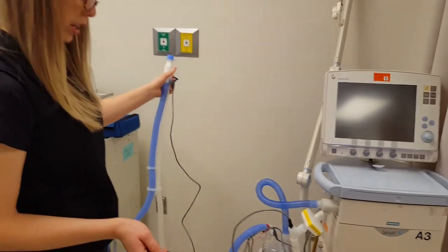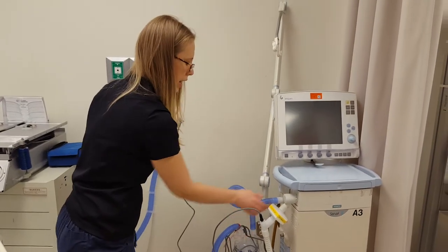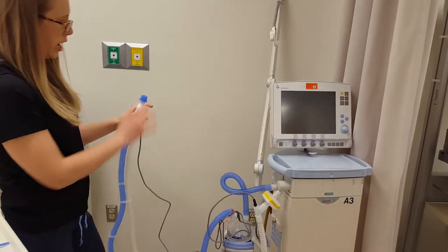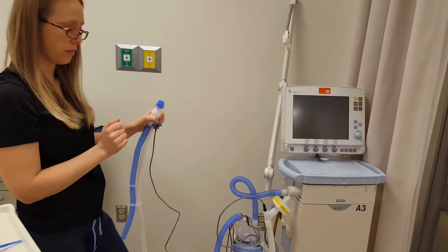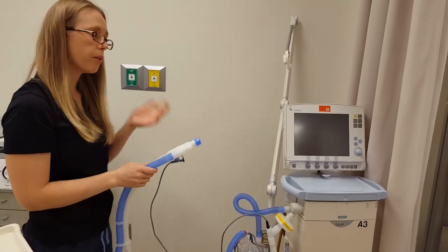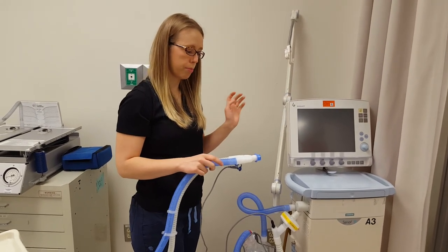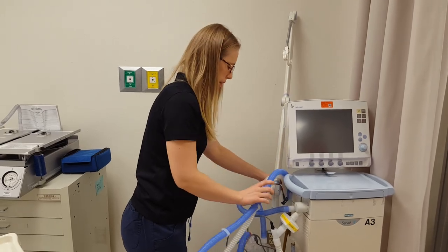Your ventilator circuit is now completely set up. Everything is in nice and tight, connections are secure, and you have a filter and a cap to cover the top of the airway. From here you can perform the check on the ventilator to make sure it's functioning properly before it's applied to a patient.